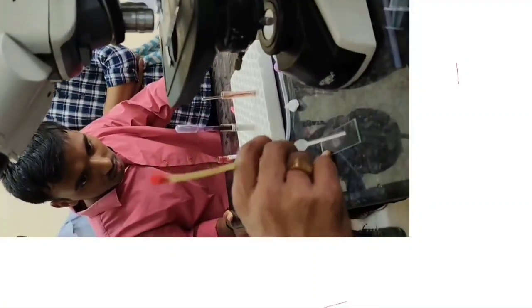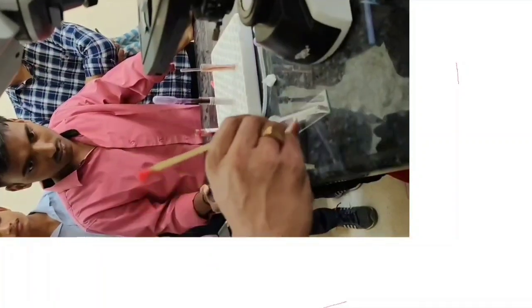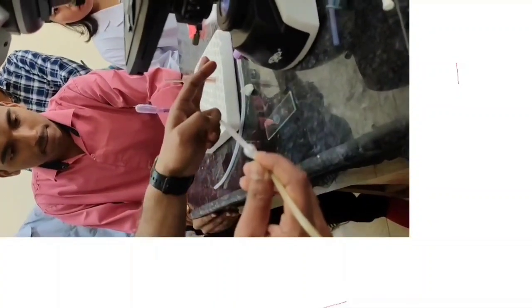And if extra blood is there, as we can see here, I am tapping this extra blood out, not putting the cotton. I have already explained why we should not use cotton. So tap it and take it out. Now it's done. Now we have only 0.5 blood in the pipette. Extra blood we have already taken out.